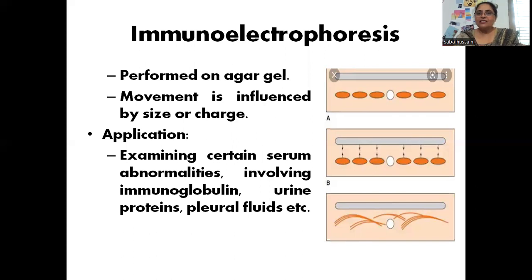So what happens in this? In this, we create different wells in the agar gel plate, and in these wells, antigens are filled.